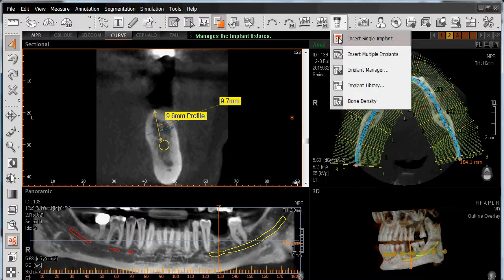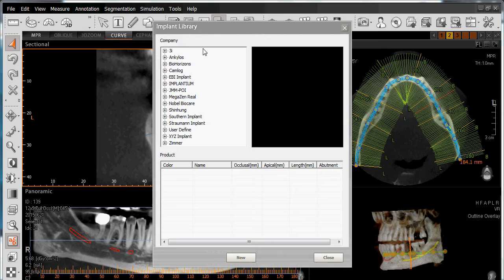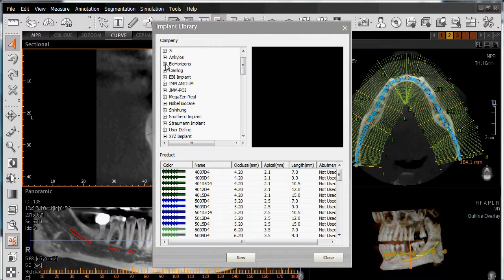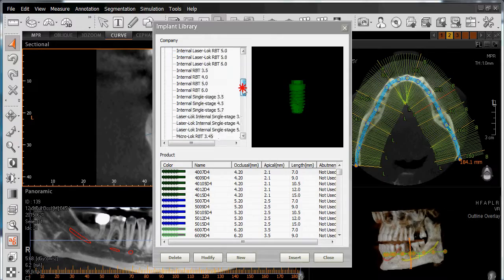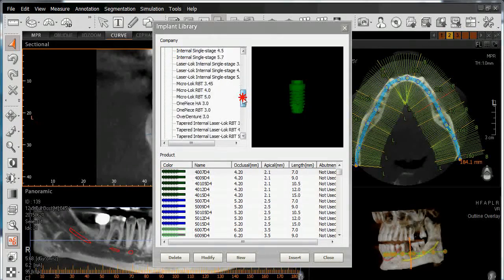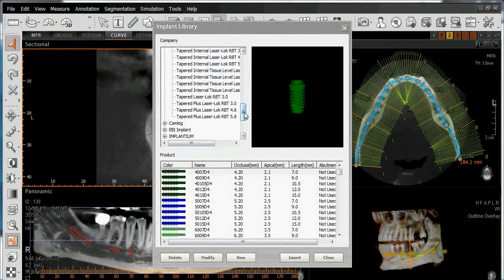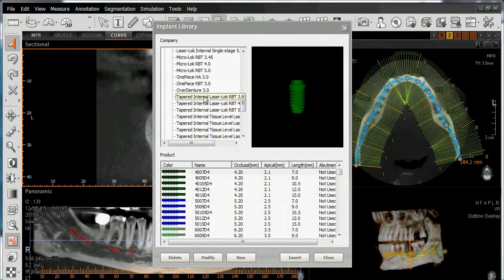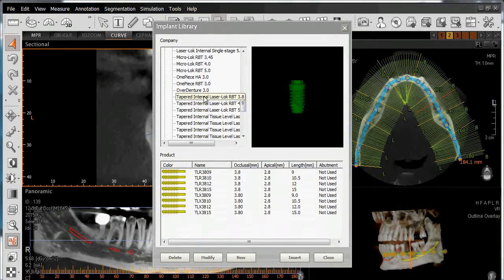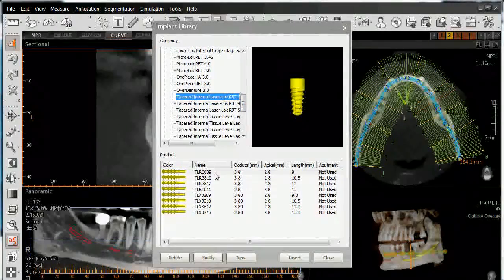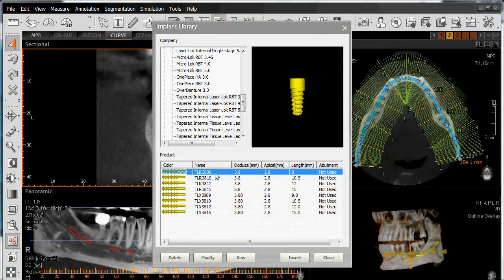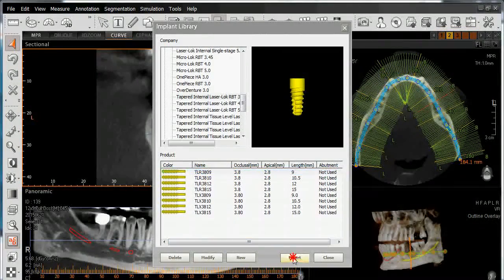Left-click on Insert Single Implant, and then choose our manufacturer. We'll work with BioHorizons, and then navigate down to the implant system we want to use. In this case, we'll work with the Tapered Internal Laser-Lok implant system. Left-click on the size that we plan to use, and then left-click on Insert.